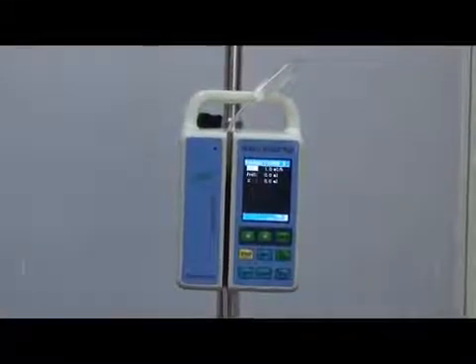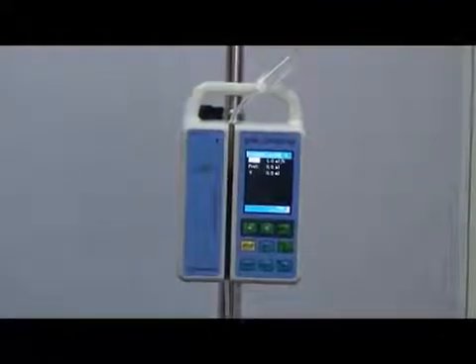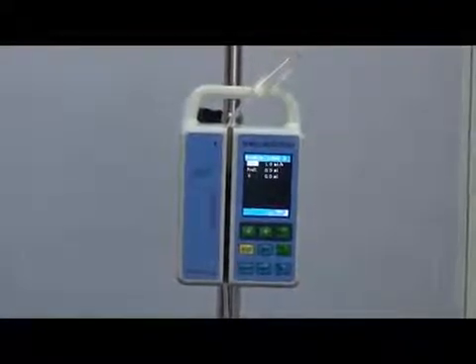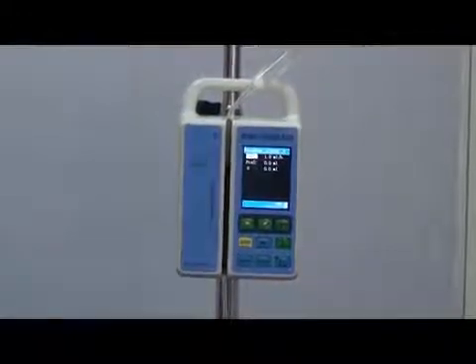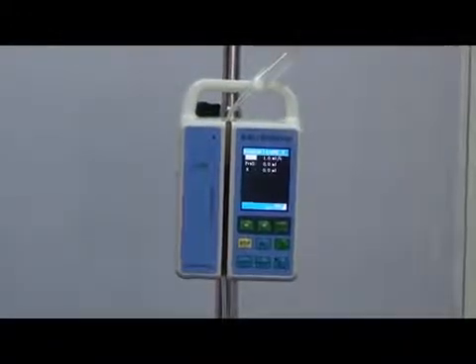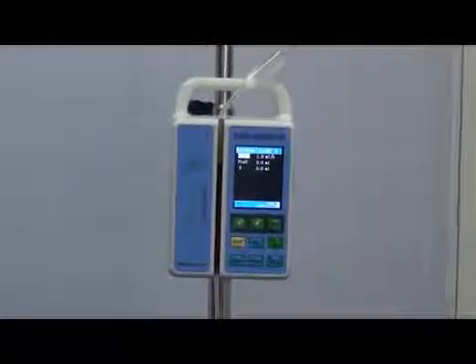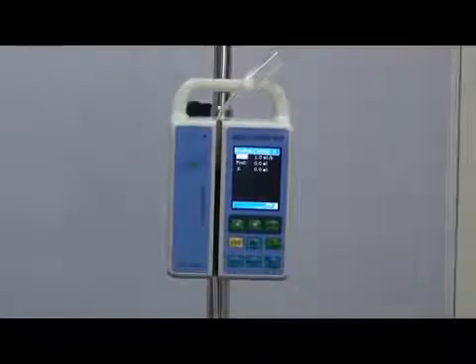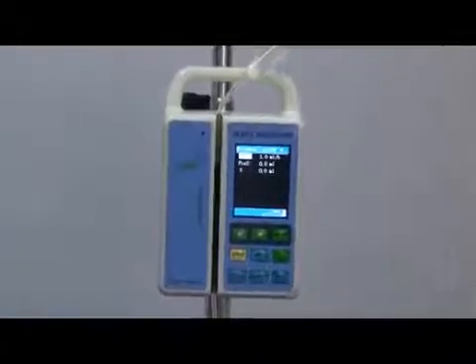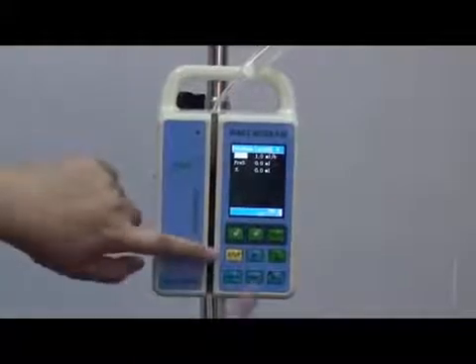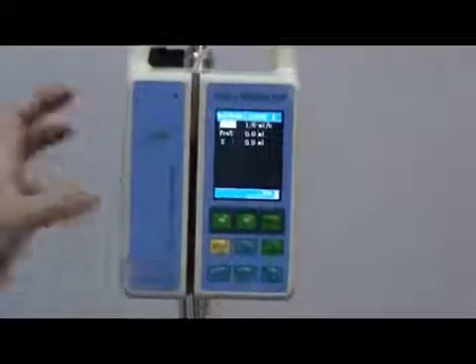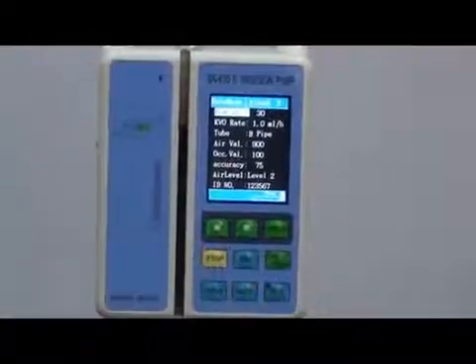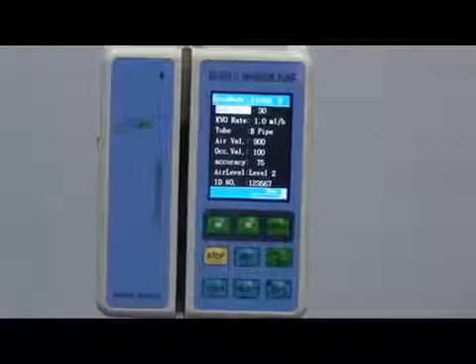So far, I have explained the three infusion modes — rate mode, time mode, and body weight mode — and how to change the parameters under those modes. I also showed you how to fix the infusion pump with the IV stand and how to fix the IV set into the pump. Now I'm going to show you some other parameters. Press stop and select keys together and you will enter into another interface.